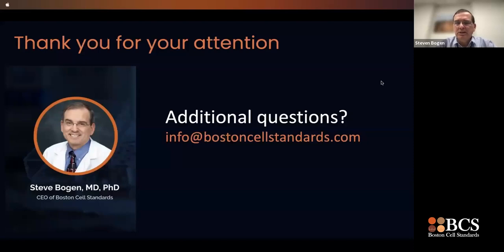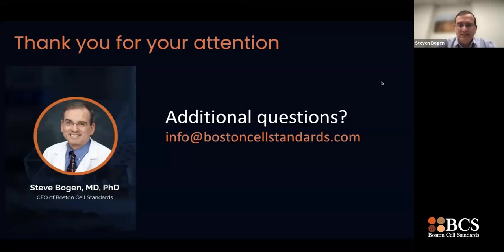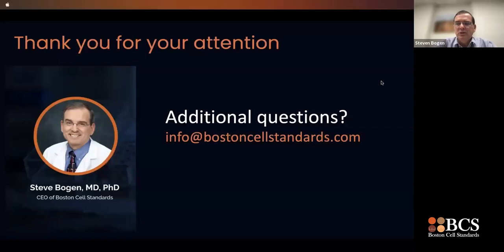You need to be aware that if your analytic sensitivity changes as you transition to the next stage of development, you will not get the same answers. So I would urge you not to focus so much on the fact that you are changing the method, but on how, in that transition, you have changed analytic sensitivity. Because if you do, you are at risk of getting completely different results.